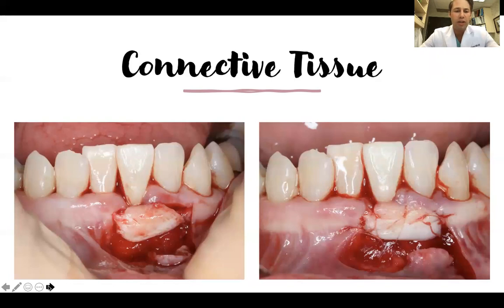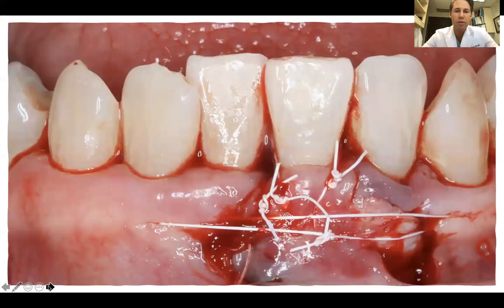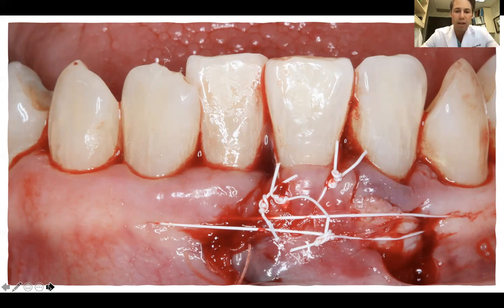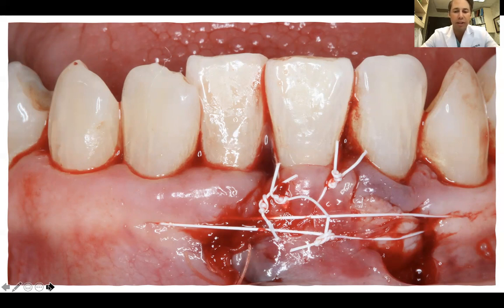The connective tissue is harvested, positioned, and sutured into place with sling sutures and independent interrupted sutures to ensure no mobility of the graft. The tissue is then coronally repositioned beyond the CEJ — we want to overcorrect for the mucogingival deformity. The connective tissue harvested was large enough to also cover site 23 to reduce post-operative discomfort during healing. A horizontal mattress stabilizing suture, sling suture, and several independent interrupted sutures help maintain the flap in the coronally repositioned position.